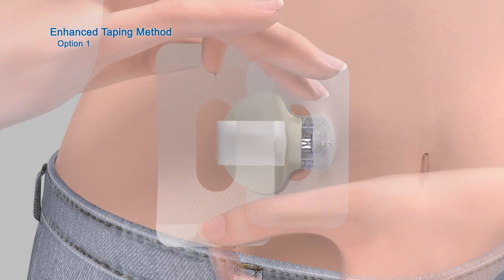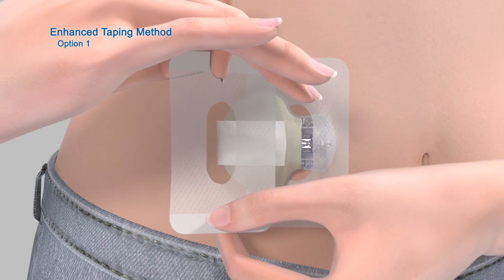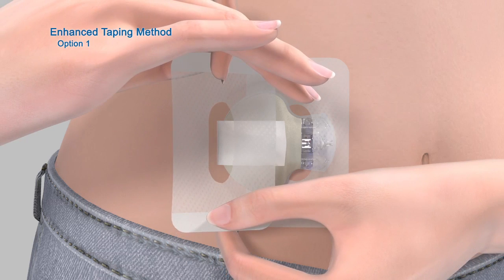Next, hold the overtape by the covered ends and position it so it is oriented the same way as the first piece of tape. Now apply one side of the overtape so that it covers the center of the transmitter, and apply the other side of the tape directly on your skin.